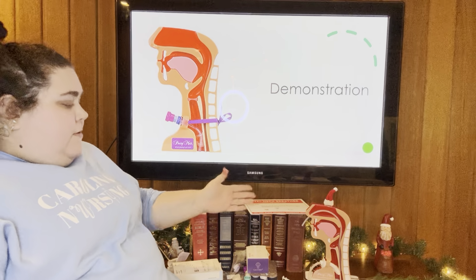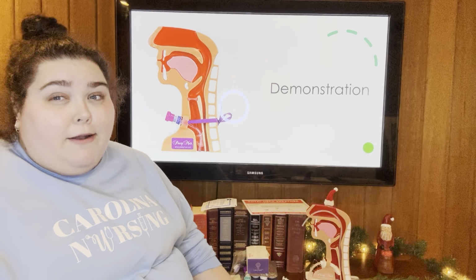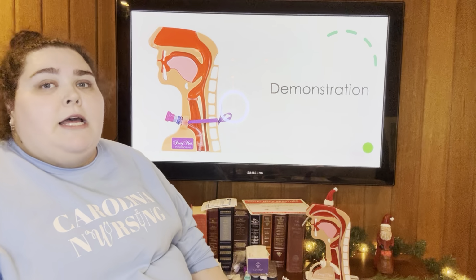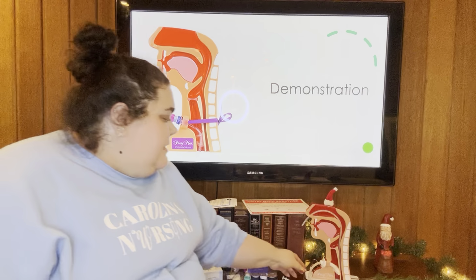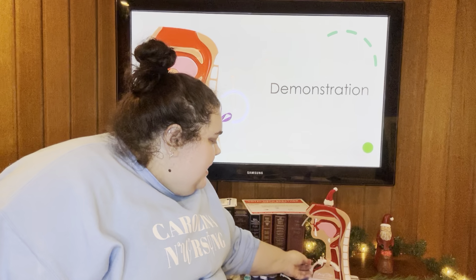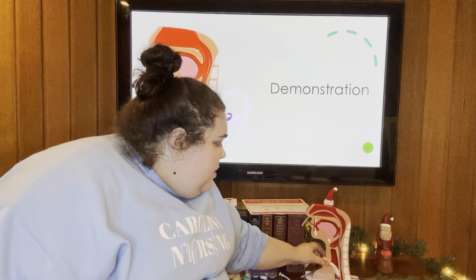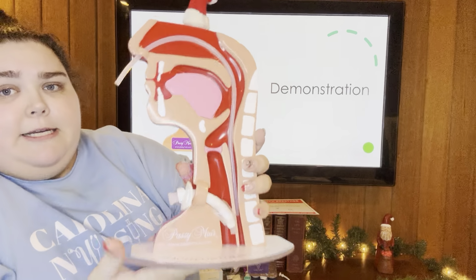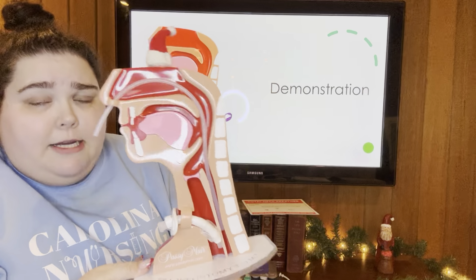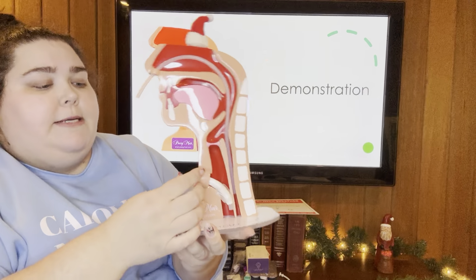So demonstration, we kind of already jumped the gun on that a little bit and talked about the different pieces. So that is how the trach fits together, and then it fits inside the airway here. And so I'll bring Tracheostomy Tom a little bit closer here so you can see. So this is Tom. He's ready for Christmas, as you can see.